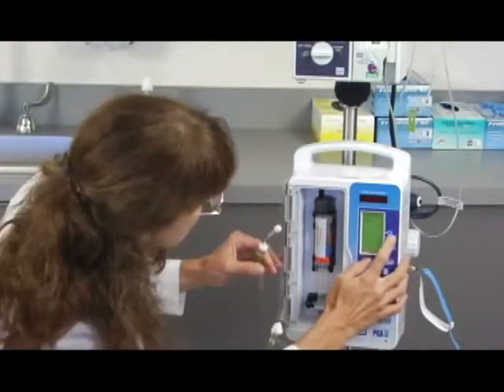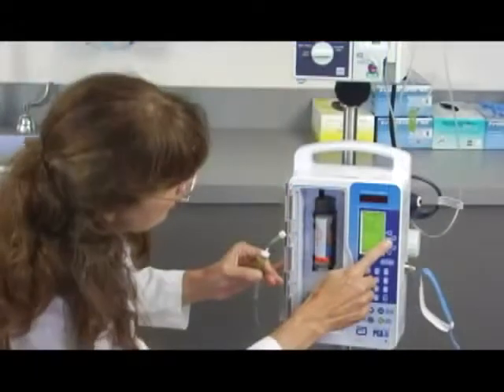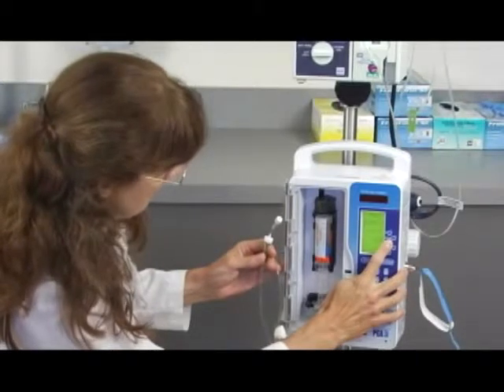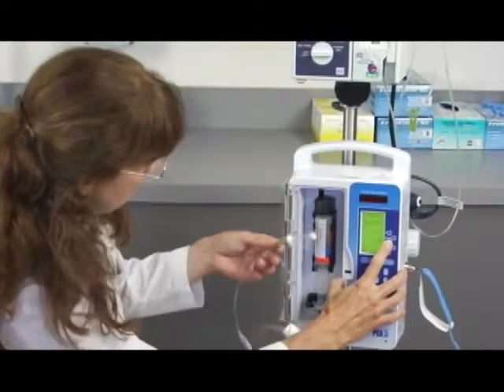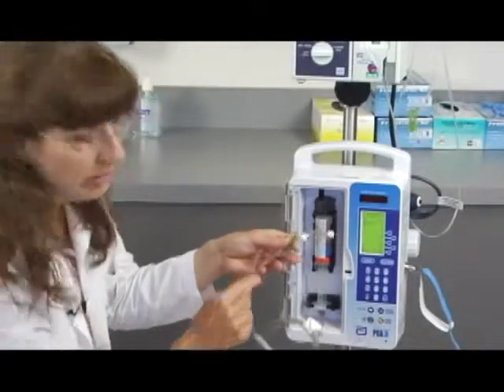But if you use the purge key to take out that slack, that will address it. So let's say yes, we want a purge. It tells us we need to disconnect from the patient, which we are. Press and hold the purge key — this is the purge soft key. I'm going to hold that for just a minute. The machine now is slowly pushing on the injector into the vial.